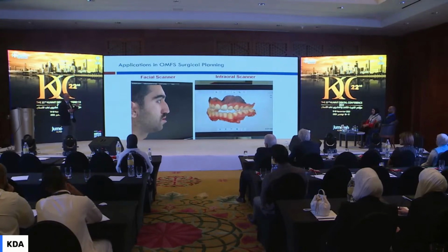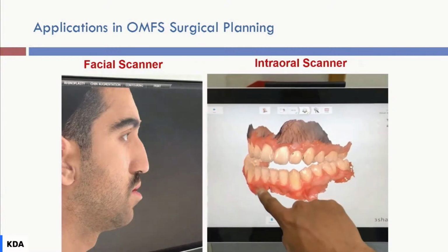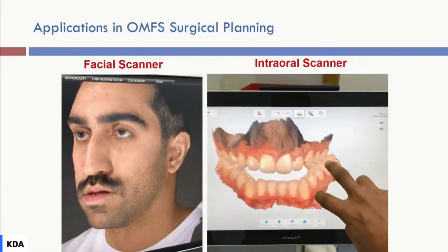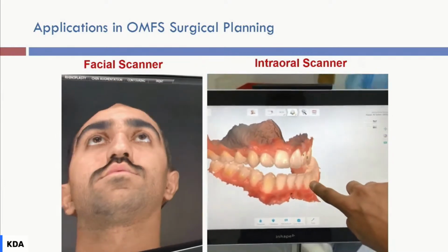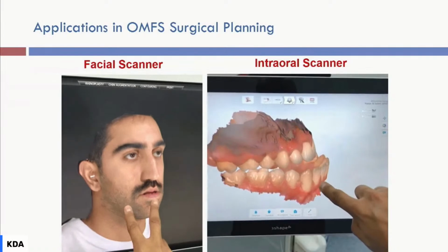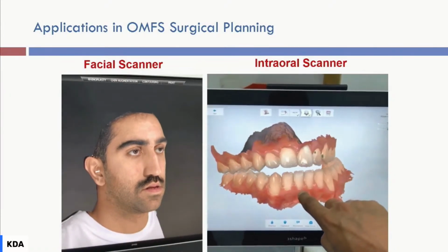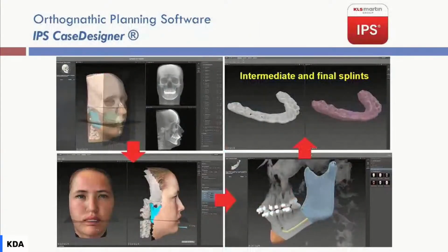Let's go ahead, and now I have intraoral scanning using a 3Shape. I have the facial scanning that I don't remember whether I took it by the phone, by iPhone, or by the Vectra camera, but it doesn't matter. They are appropriately taken 3D cameras. So 2 of them, I make sure they are high quality, good resolution. They both look good. Then I will use this to construct the skull of the patient, and based on that, I can do my analysis and proceed with the treatment planning.